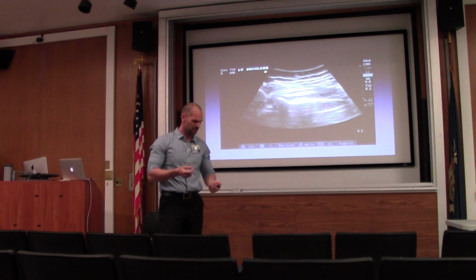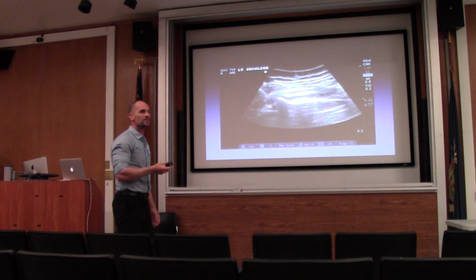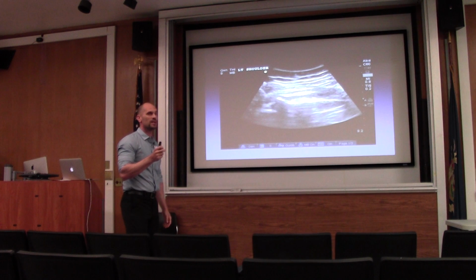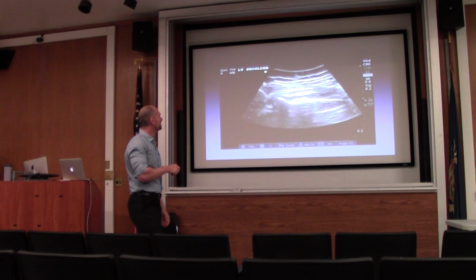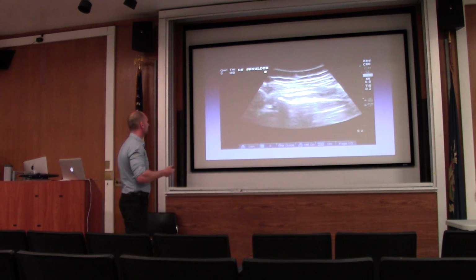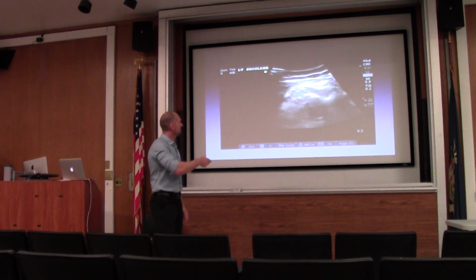Now, word of caution, when you do these, some patients will be a little bit bigger than others. When you have these bigger patients, you'll probably want to use a 3.5-inch spinal needle, because even the 18-gauge needles will probably not reach. You'll end up feeling a little disappointed in yourself and a little bit short, and you may just not reach all the way. So it's important to use a longer needle to get into the space.